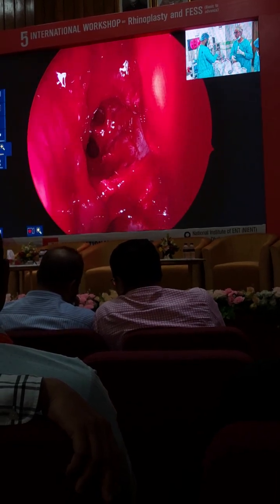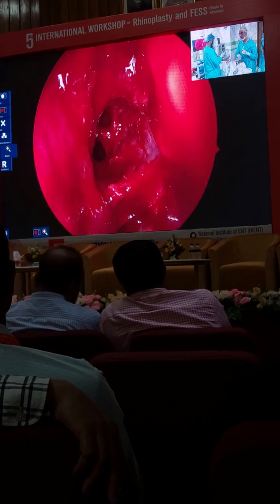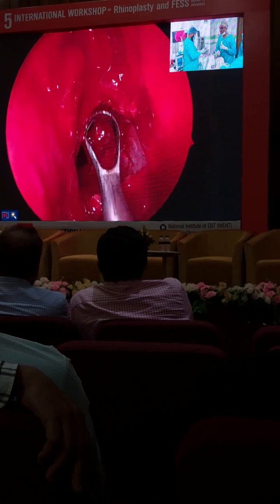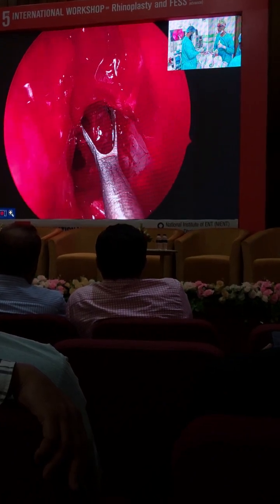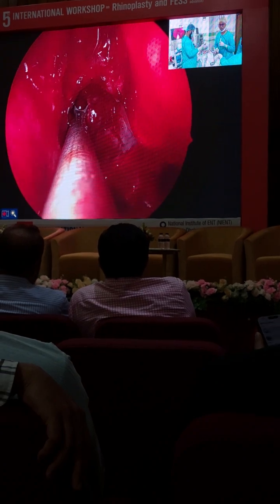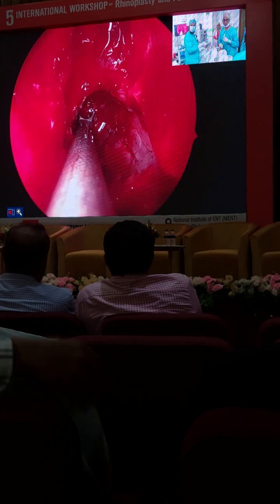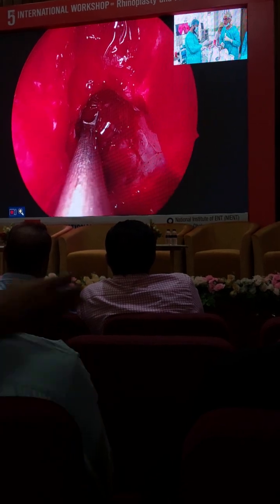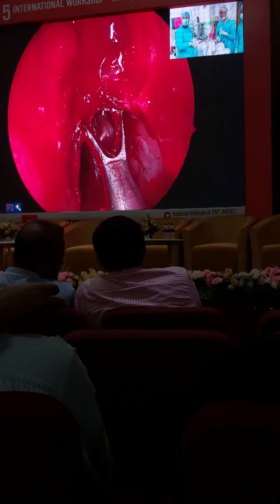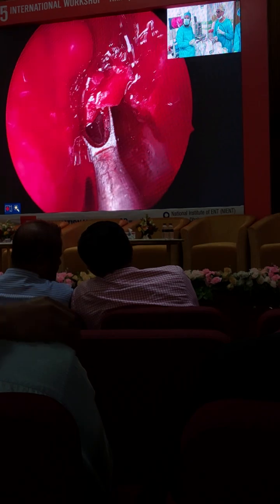Do that again. So instead of taking a debrider and pushing up here, which is a little dangerous because the bone is a little hard. If the bone was a little soft, that would have been okay. Now if my skull base is over here, posteriorly, the anterior skull base has to be at a higher level than this. Simple. Exactly. Correct? So I know that this part cannot be skull base. So I'm trying to get in here so that I can fracture the bone.